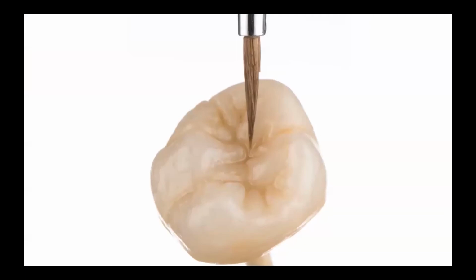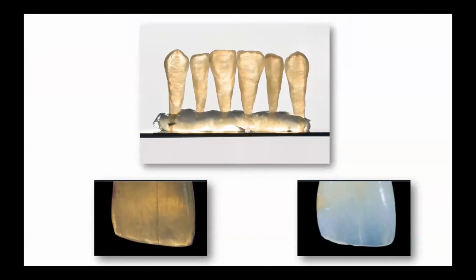And I would like to start my lecture about individualization of all ceramic restorations from the staining technique. Due to the development of framework materials and CAD/CAM systems, that technique has become the favorite one for the majority of dental technicians. And the modern all ceramic framework materials not only have a warm color, they are opalescent too, like Celtra Press or Celtra Duo.